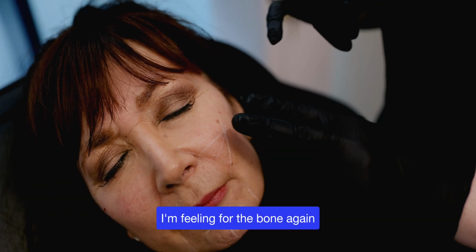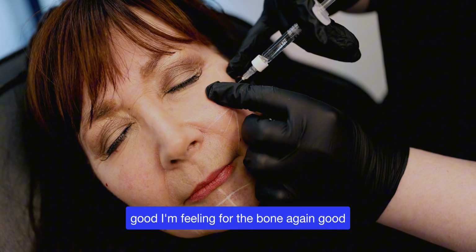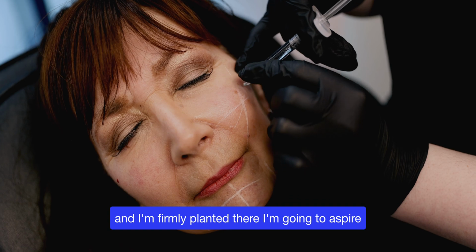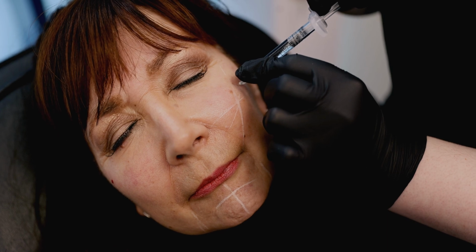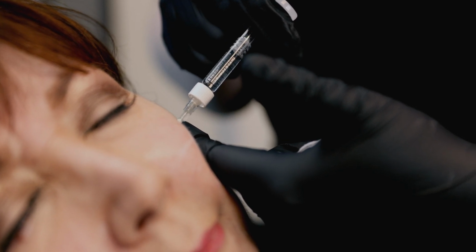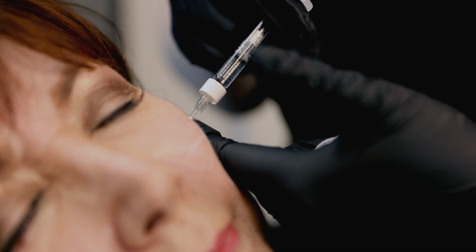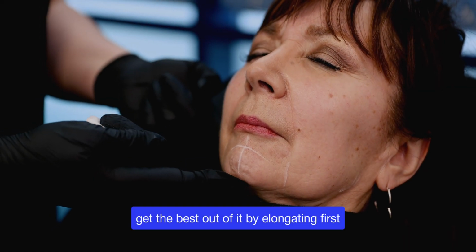I'm feeling for the bone. Again, stretch the skin. And at 90 degrees, I want to hit the bone. Sharp scratch. And I'm firmly planted there. I'm going to aspirate. To the lower face, and I'm going to push 0.3 of a mil. Lovely, well done. Get the best out of it by elongating first.